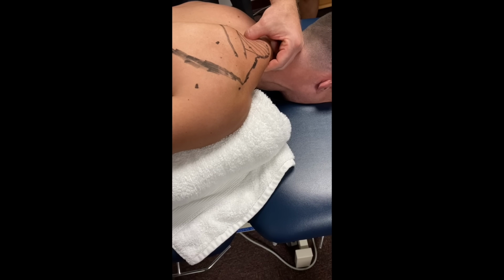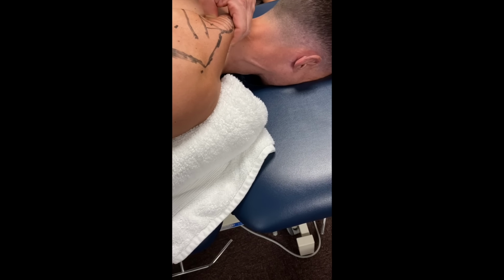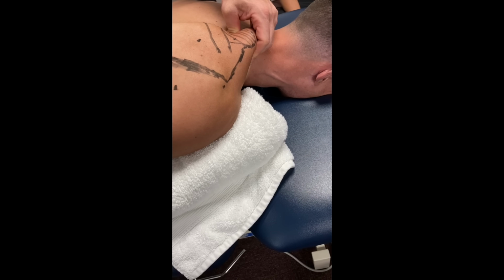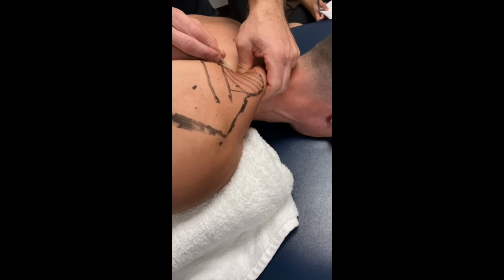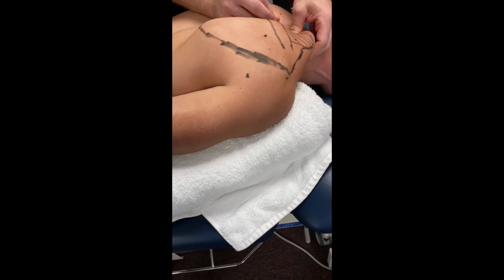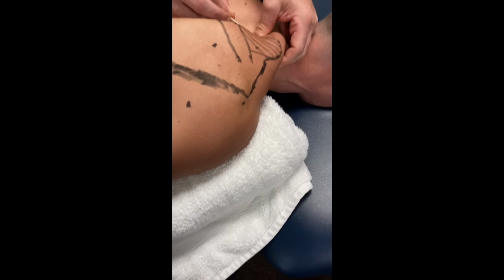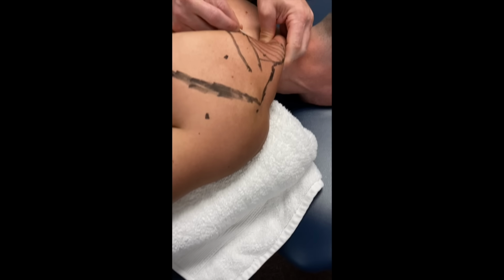Question between the upper trap and the middle trap. Can you see how my fingers shoved in between those two things? We're gonna put the needle into this depression between the upper and middle trap. And I'm gonna needle inferior medial to superior lateral, such that I needle away from the lungs.